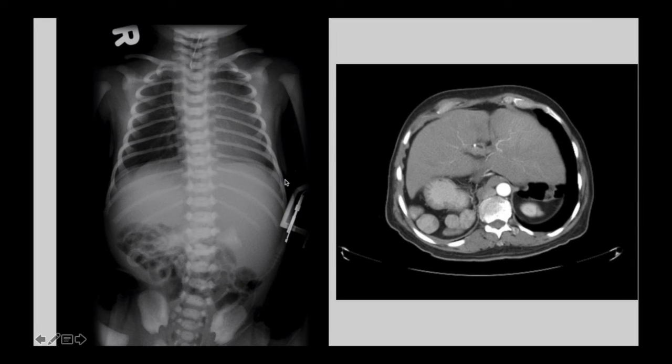And this is another patient with heterotaxy syndrome, a patient with situs ambiguus with left isomerism. Patient has polysplenia with no dominant spleen on the right side, a midline located liver, and also not shown in this picture, patient also has azygos continuation of the inferior vena cava.